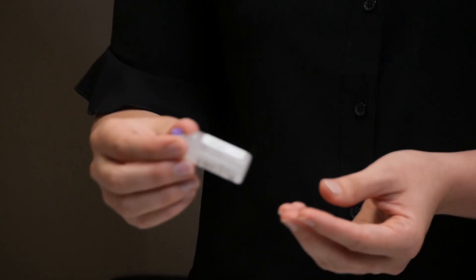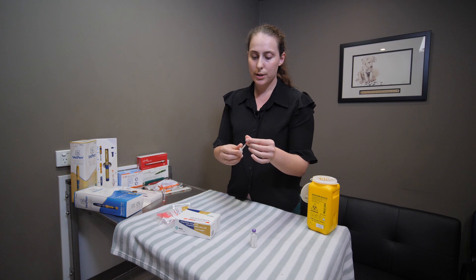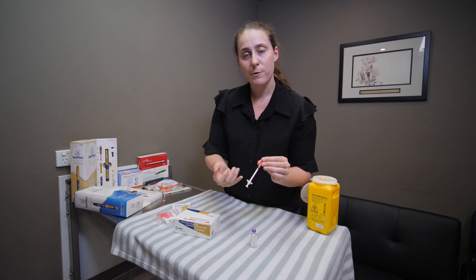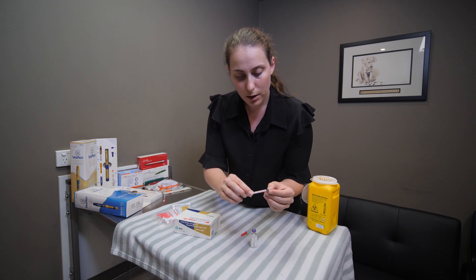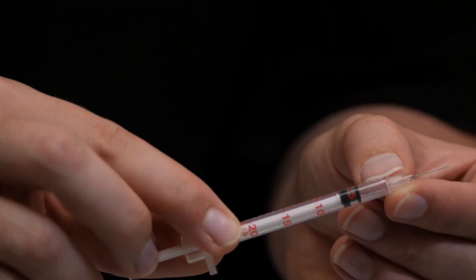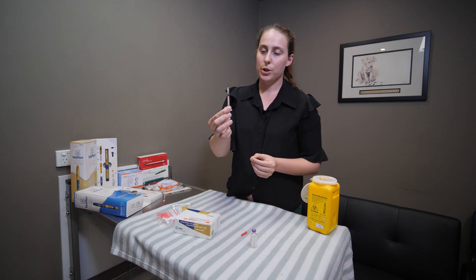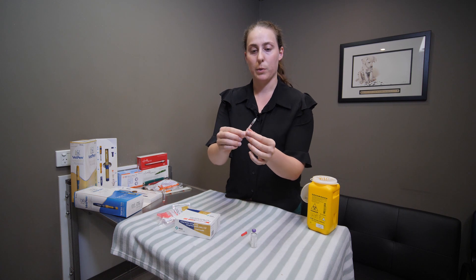Once you've agitated the insulin to a nice cloudy appearance, draw up your dose. Along the side of the syringe you can see gradients: 5, 10, 15, and 20 units. If you have a small dog you might be drawing doses smaller than that, such as two or three units. On this syringe, individual one-unit increments are the smaller red dashes between the fives — it's important not to get confused by the very first mark, which is zero. When drawing up, measure to the top of the rubber stopper, not the bottom.